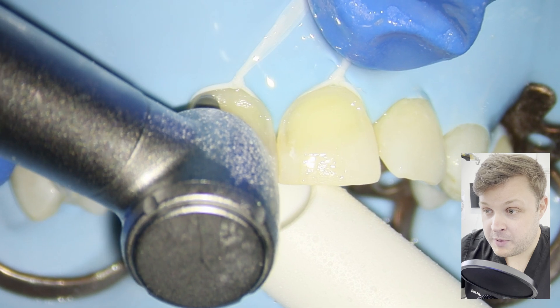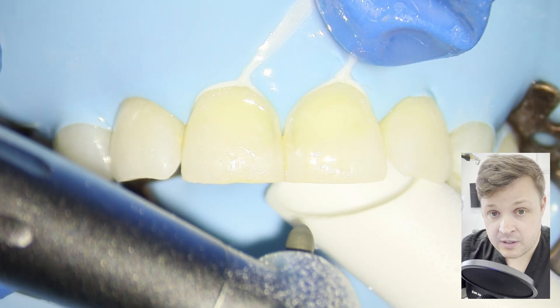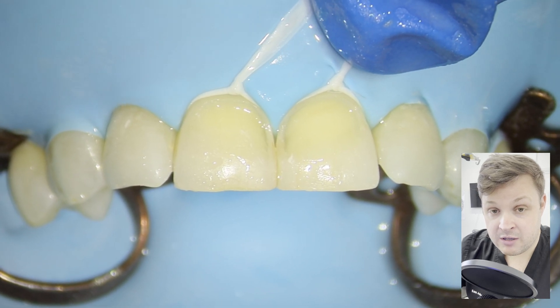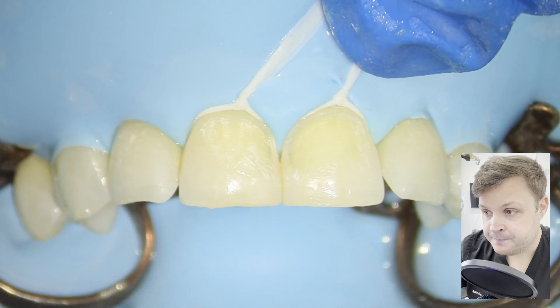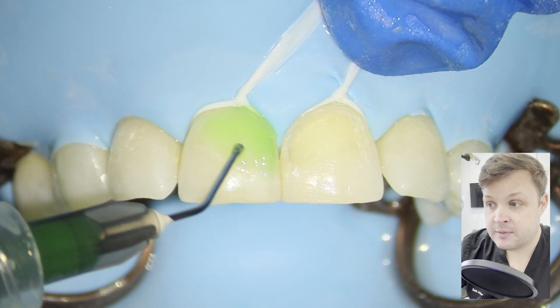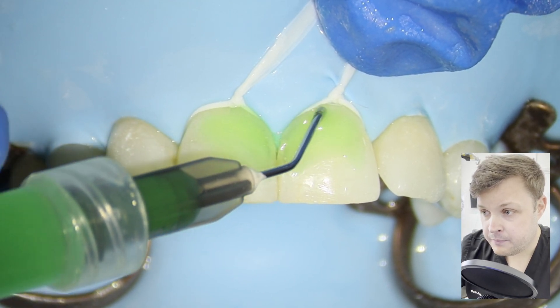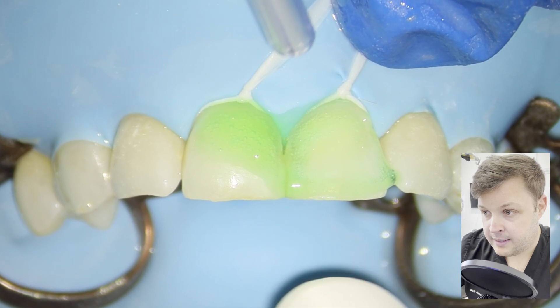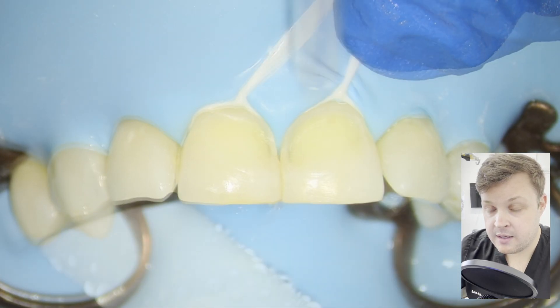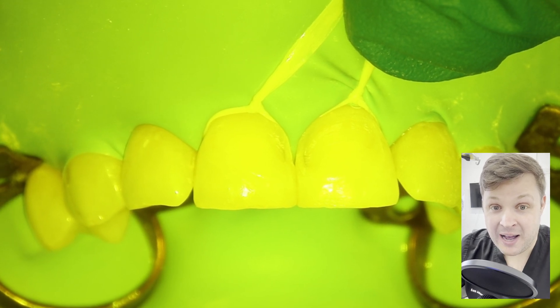I'm using a rugby-shaped, finer grit diamond burr here, and I'm just cleaning up the cavity a little bit and also beveling the margins. It's a bit difficult to bevel the margin near the floss tie and near the gingival margin — you have to be really careful you don't catch the floss tie or the rubber dam. Because this is mostly enamel, probably a tiny bit of dentine, we're mostly bonding to enamel here. I'm going to use etch all over the tooth, then wash it away really thoroughly. I've been told you wash for as long as the etch was on — so if you etched for 20 seconds, you wash for 20 seconds.